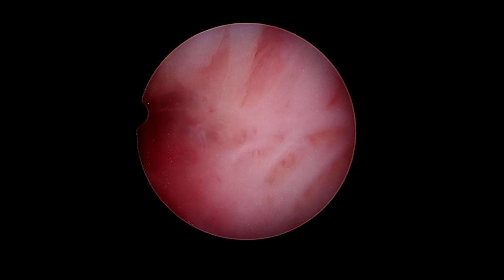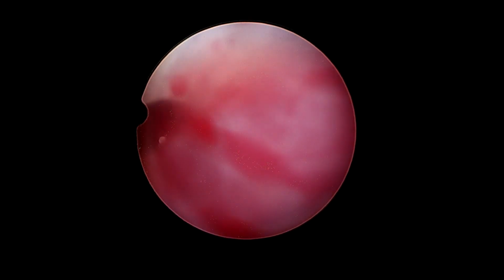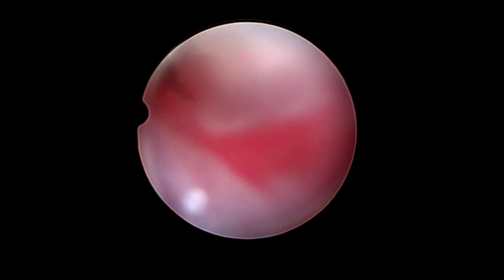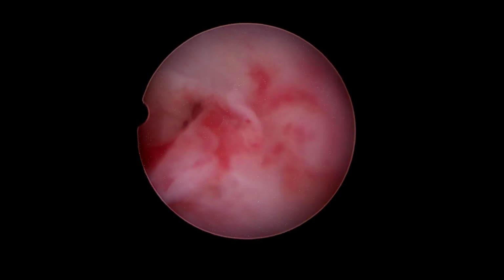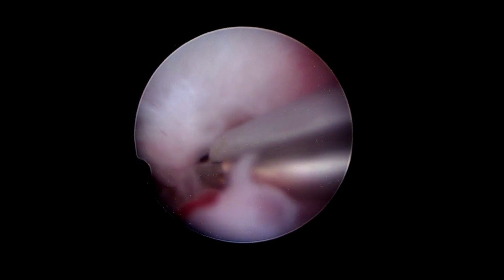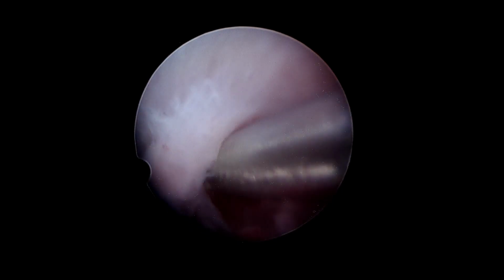Once we went inside the cervix, we realized the cervical canal was normal, but the internal os appears to be stenosed. We tried to push the scope through the internal os, but you can notice there is an adhesion right in front of us, starting from the internal os.